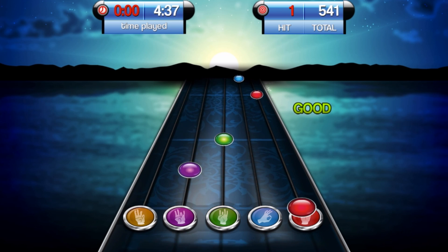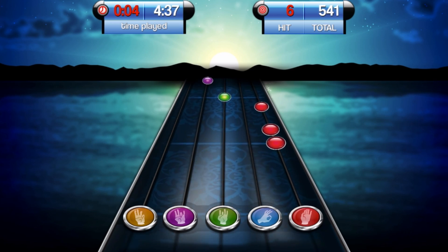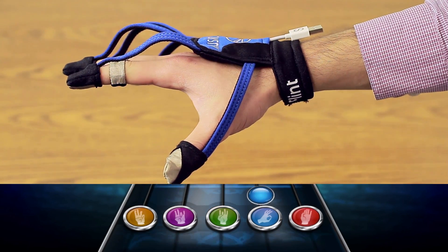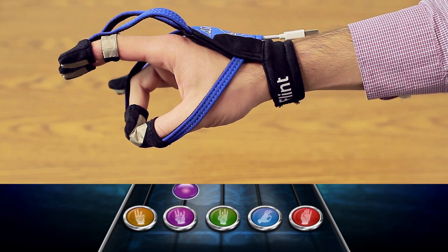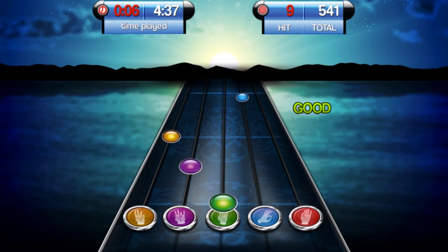In the game screen, you must make the appropriate grip when the colored dot passes through the respective circle on the bottom of the screen. Start by focusing on a single grip until you're able to hit at least 50% of the notes for that grip. Do not be discouraged if you're only able to hit a few notes per song. As you continue practicing, your performance will improve.